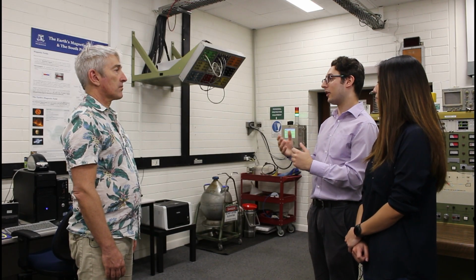The highest energy particles will travel around on the outer circuit, and everything in between will travel around going in between those two. And I kind of might notice that my hands are going like this as I go around, because the particles really do. They kind of wiggle as they go through. They don't just travel in these perfectly straight lines. Inside the magnets, they bend, they move around, the beam gets larger and smaller as they go around and as they're focused.